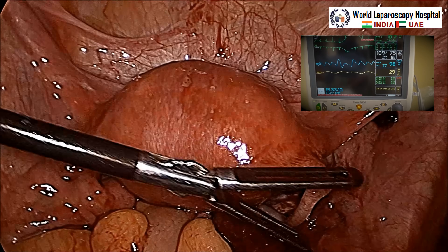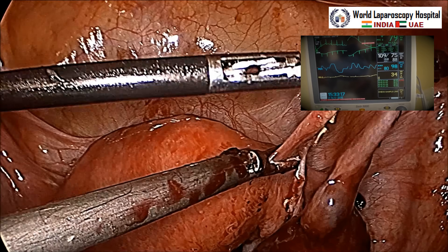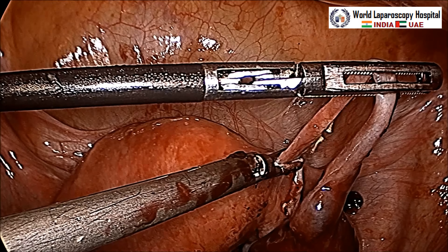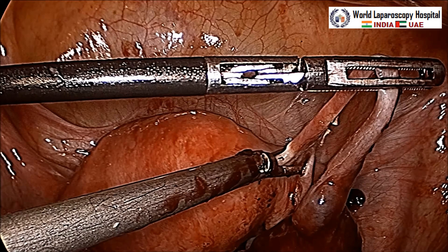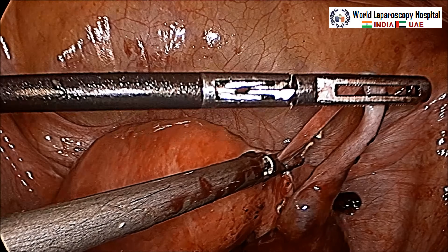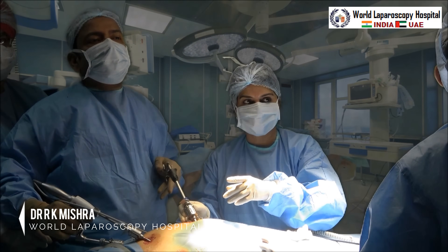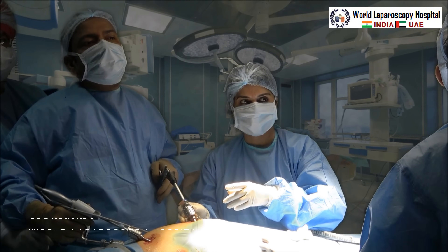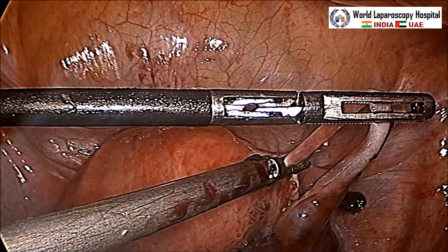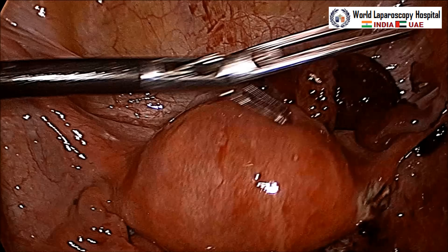Now slowly the entire tube is cut medially. Coagulate five to six millimeters of the tube to prevent a uteroperitoneal fistula — it is important to coagulate the medial aspect of the tube. After that, cut it out. This was a simple case because luckily there were no clots inside; it was a freshly ruptured ectopic pregnancy. In ectopic pregnancy, perform surgery as soon as possible — delaying is risky because the patient may be compensating and then suddenly go into irreversible shock.